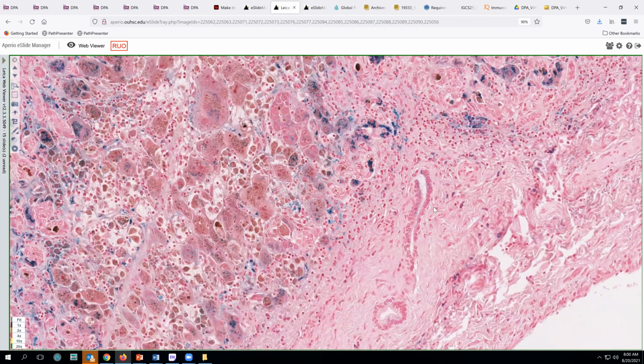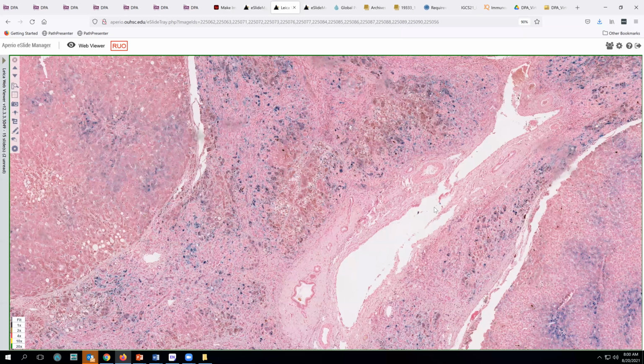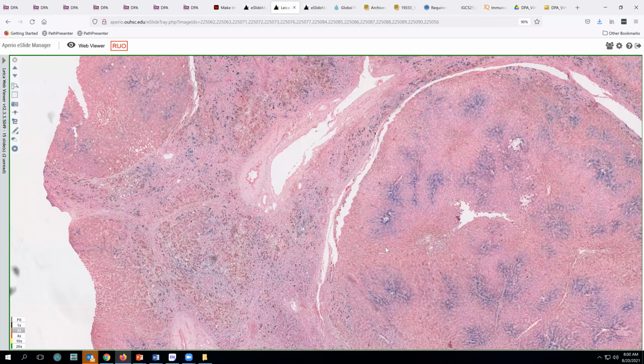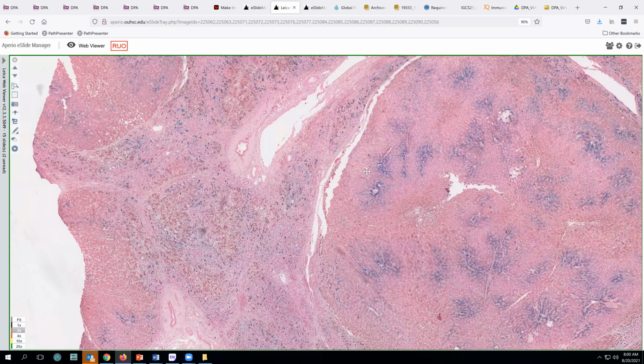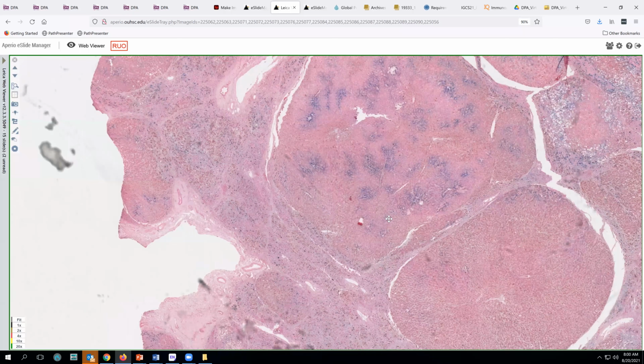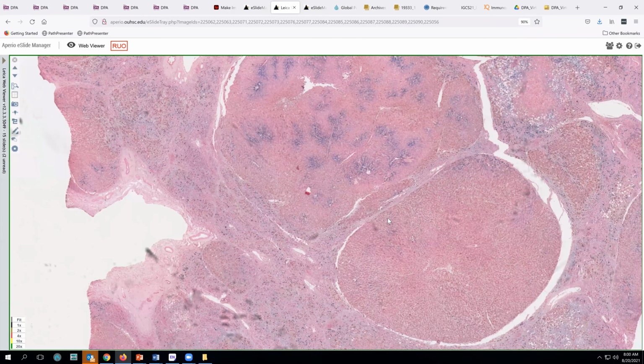So that's, I think, very helpful to assign this case the diagnosis of hemochromatosis, which is not uncommon for patients to go many years without a positive diagnosis to explain their findings. And hemochromatosis is notoriously underdiagnosed.